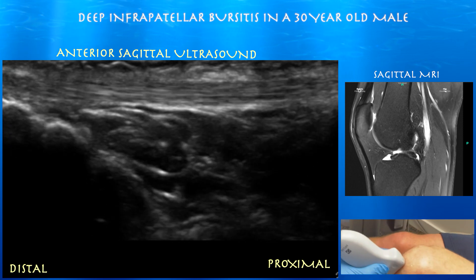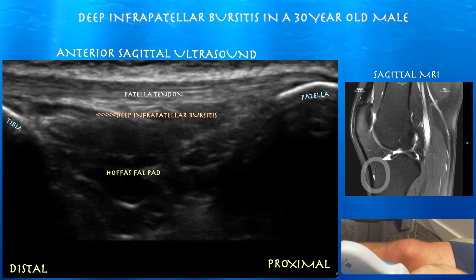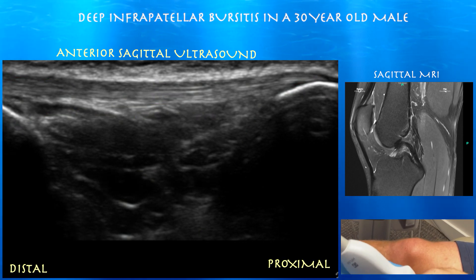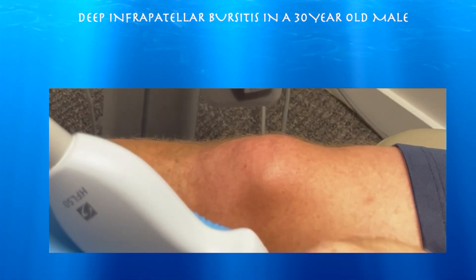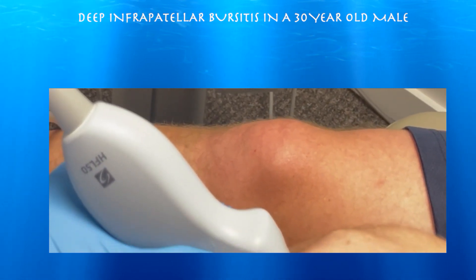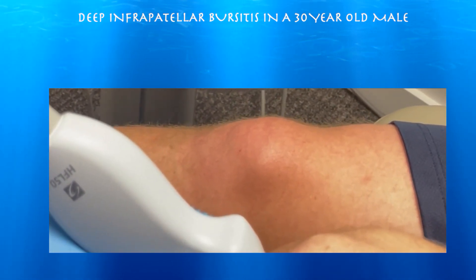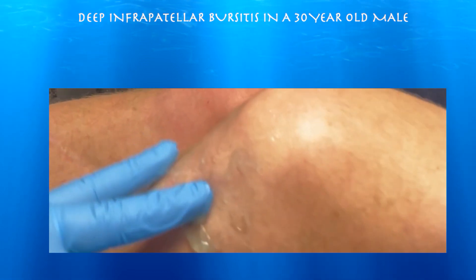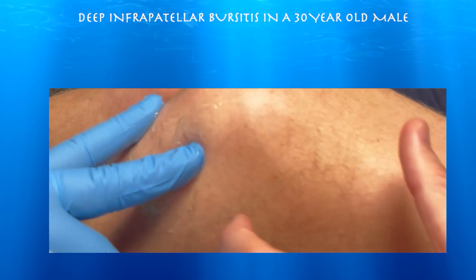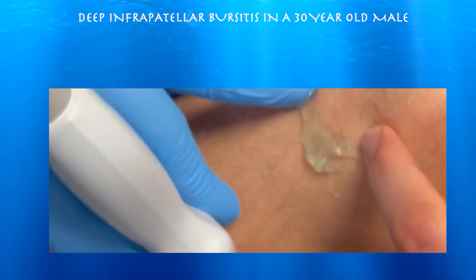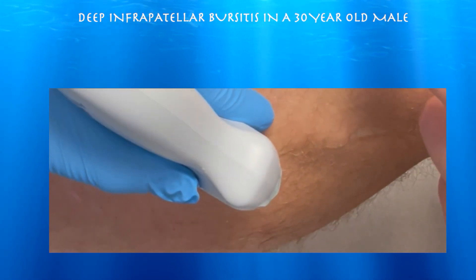Here we are at 11:04. We can see a little bit of fluid under the distal aspect of the patella tendon that is compressible. Is there any swelling in this region? Maybe a little bit — if you flatten it you see a little bump where you don't see a bump on the right side. Right around here — yeah, right in that region. I'm seeing fluid right over here, underneath here.